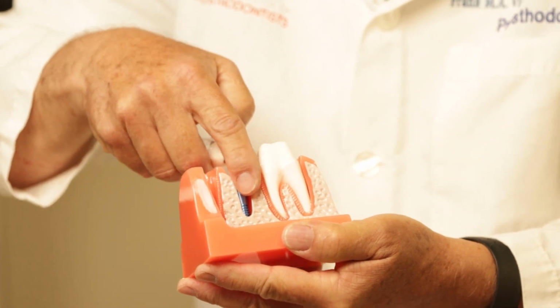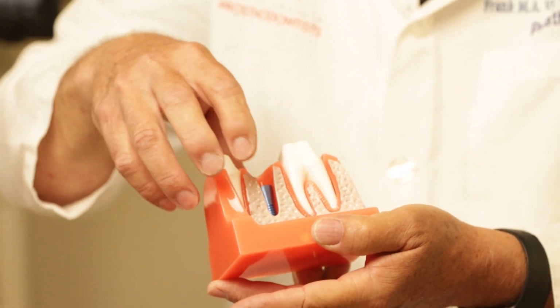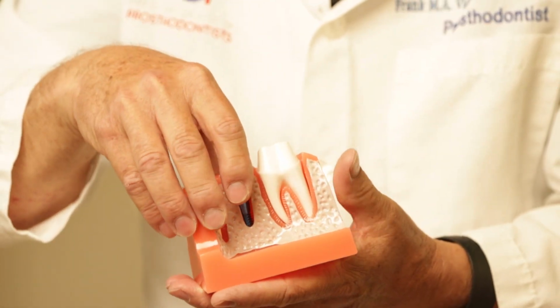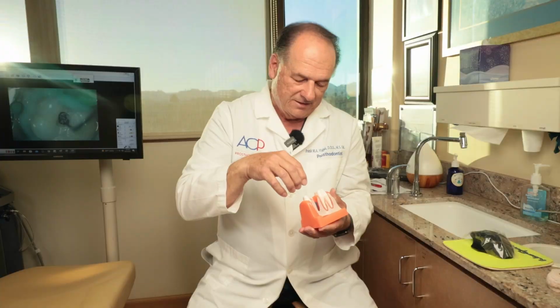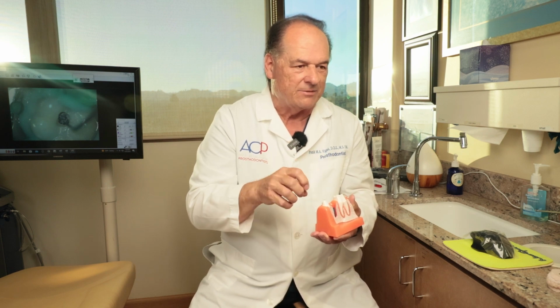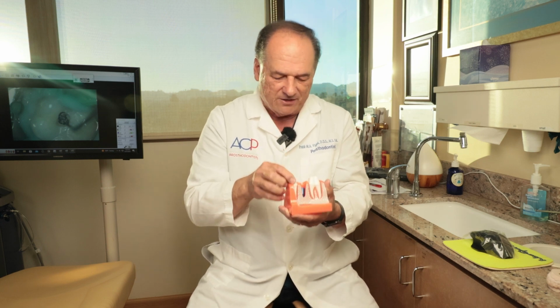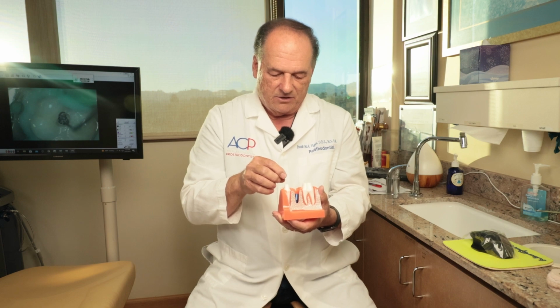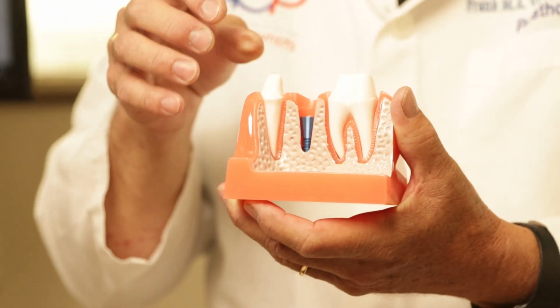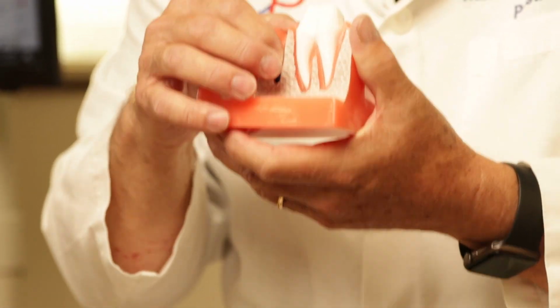The big difference between an implant and a tooth: we have a root, and that root is held into place by fibers. We call it the periodontal ligament. That gives the tooth the ability to make movements, like a shock absorber. It's a reparative structure, so if there's minor damage down around the root, it can heal itself. It gives you the ability to feel, so when you feel pressure, that's coming from the ligament. An implant won't give you that. The implant connects directly to the bone.